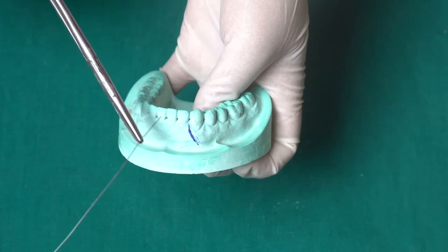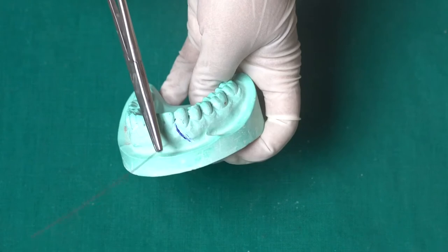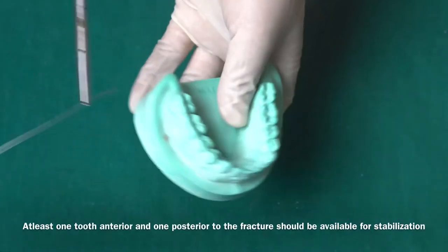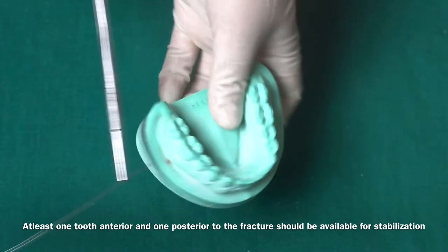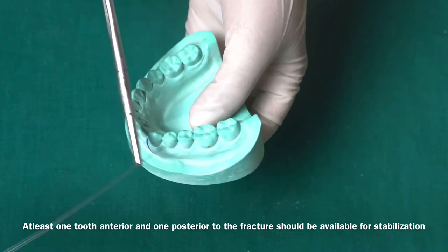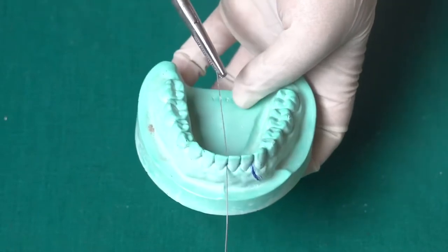According to Gilmer's wiring rule, we take at least one tooth in the anterior segment — we can take the central incisor here. We are not going to take the lateral incisor or canine as they involve the line of fracture. In the posterior segment, we need to take a minimum of one tooth, and again in the other posterior segment we take another tooth — it can be a molar or premolar.